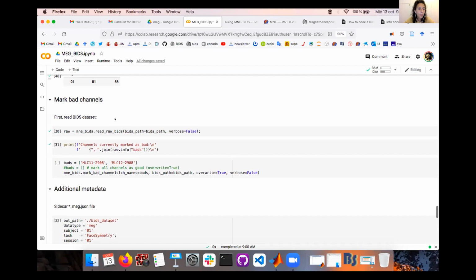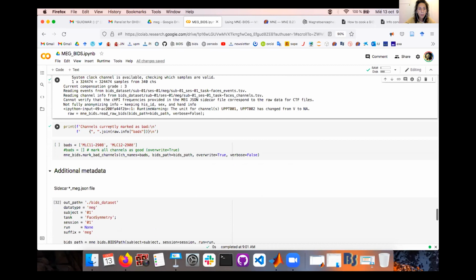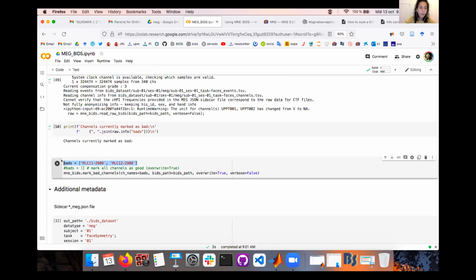And finally, well, not finally, but maybe you want to mark some channels as bad. If we read our BIDS dataset from our new BIDS path, the one that we have just created, and print which are the bad channels, there are no channels marked as bad currently. So we can say, okay, we know that these 2 channels were bad in this recording or in this session.